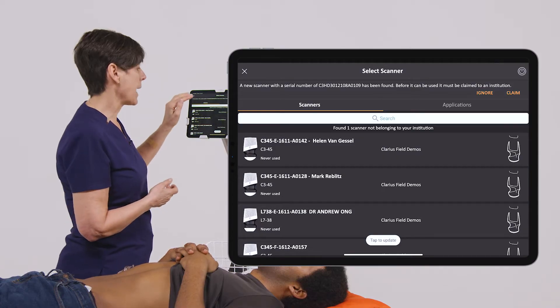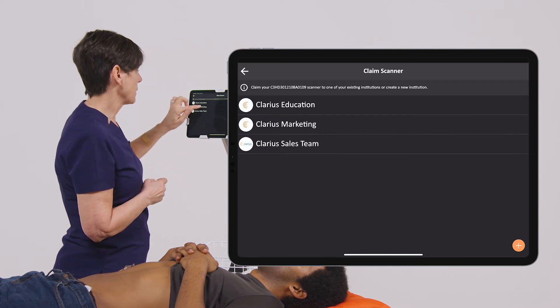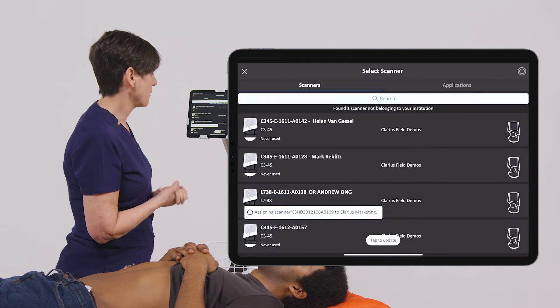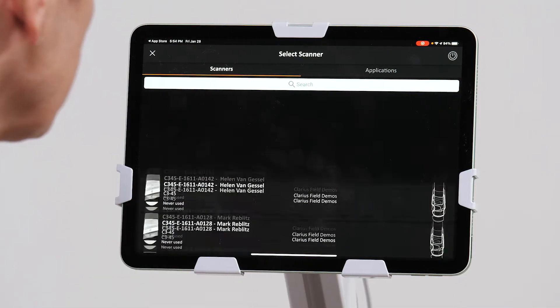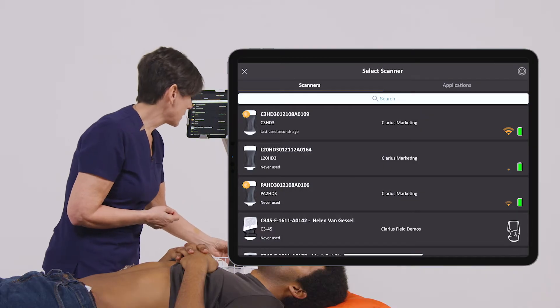So now this is detecting a new scanner, so this is where I'm going to claim our scanner. I'm going to click on our scanner for our account and confirm that. I'm going to hit update. So now I can see my scanner at the top of the list here.